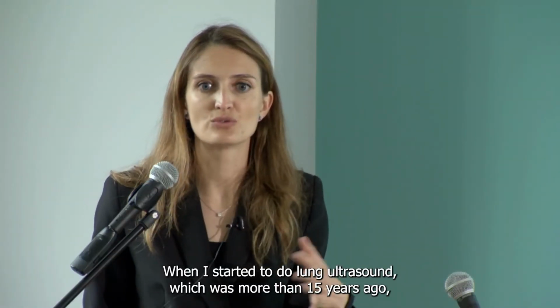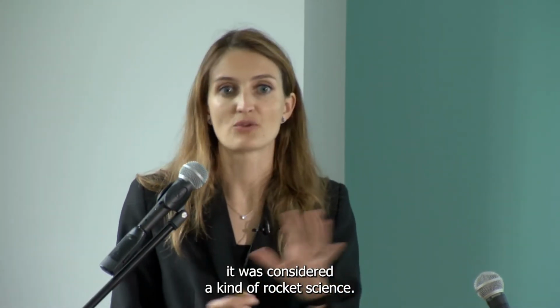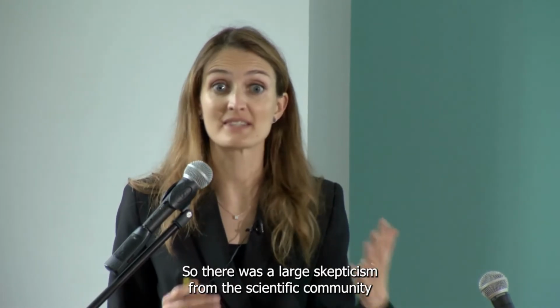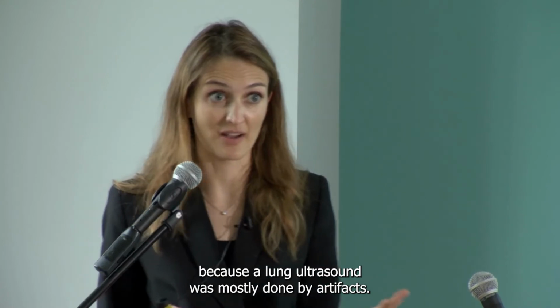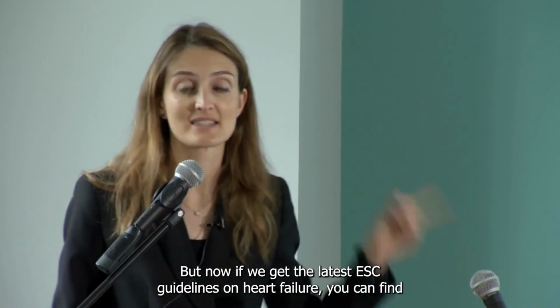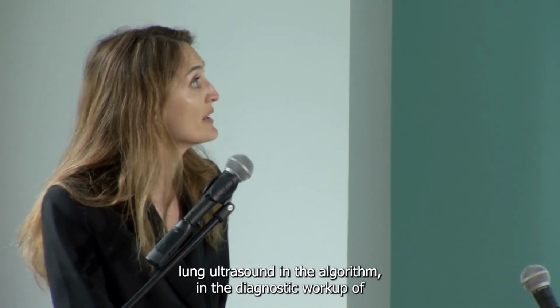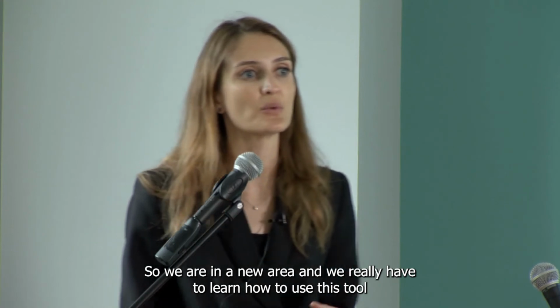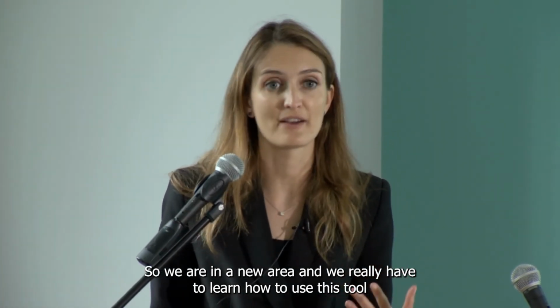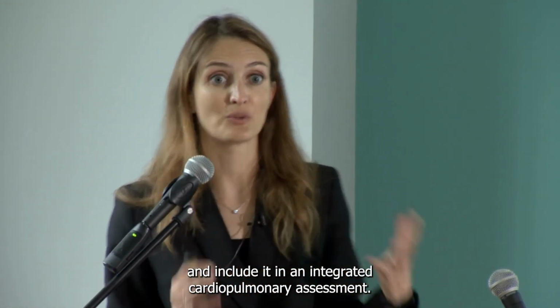When I started to do lung ultrasound, which was more than 15 years ago, it was considered a kind of rocket science. So there was a large skepticism from the scientific community because lung ultrasound was mostly done by artifacts. But now if we get the latest ESC guidelines on heart failure, you can find lung ultrasound in the algorithm, in the diagnostic workup of the suspicion of acute heart failure together with echocardiography and chest x-ray. So we are in a new area and we really have to learn how to use this tool and include it in an integrated cardiopulmonary assessment.